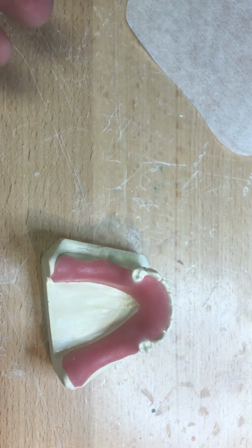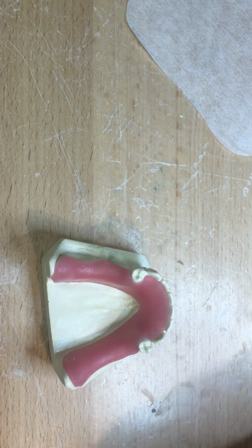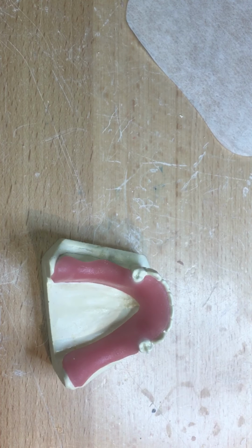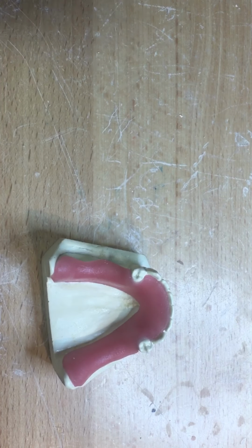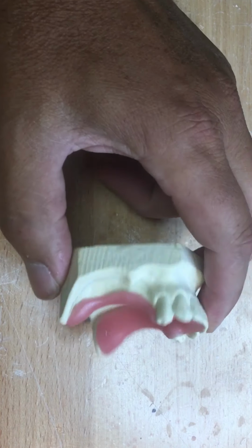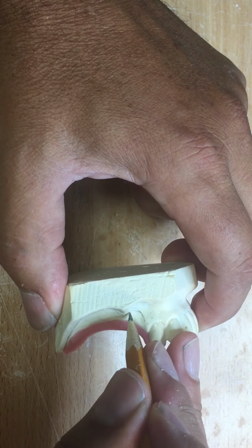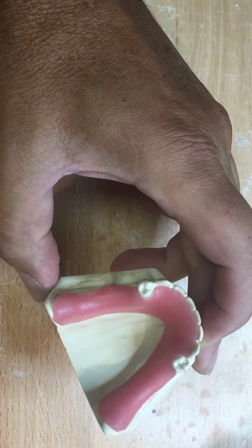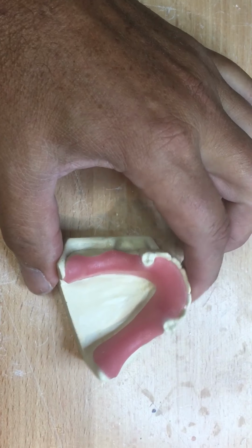Now this is actually our project 2 that we're creating a framework for, the denturism. But I find that if I use the same model, like I said, that we're using, you'll just come to the front and copy my lines and not really apply any of the principles to your model, except just monkey see, monkey do. Oh, that's where you drew the line? That's where I'm drawing my line. This way, you'll have to make a choice, a decision with your own pencil of where the attached and detached mucosa is, which I think you can do. So I'm going to light cure this real time, 1 minute.